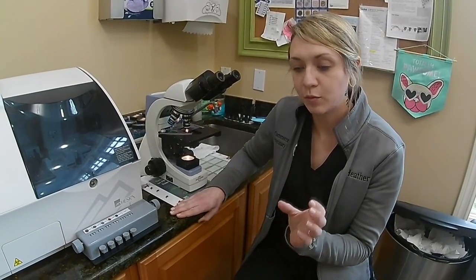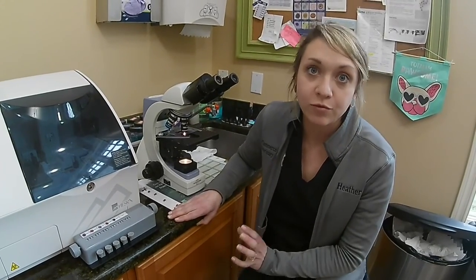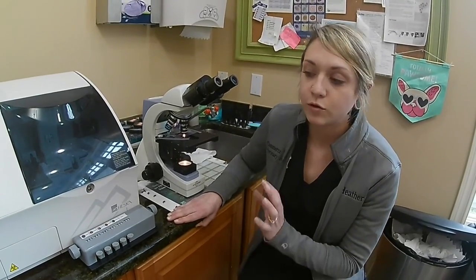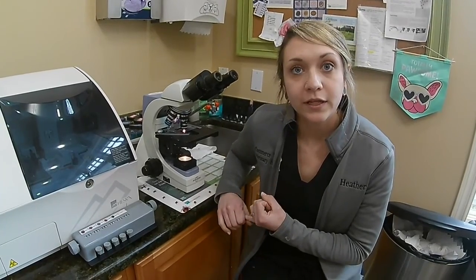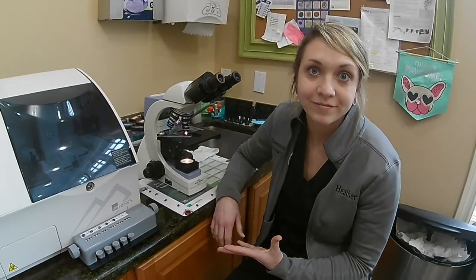You would take the percentage, multiply it by that number, and then that would give you your absolute value for lymphocytes. So you would have that, you would have your number of platelets, and then we're going to move forward and find our percentage of red blood cells.